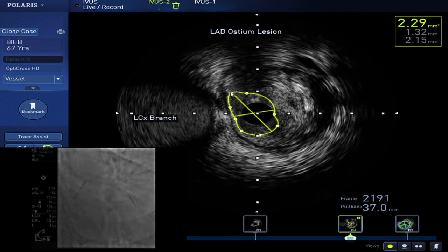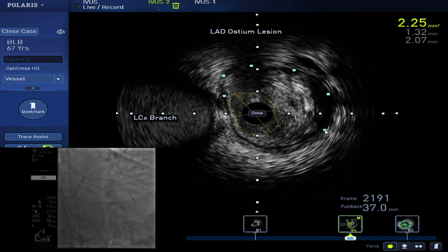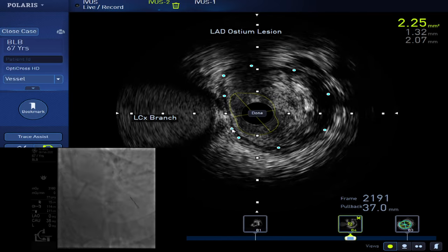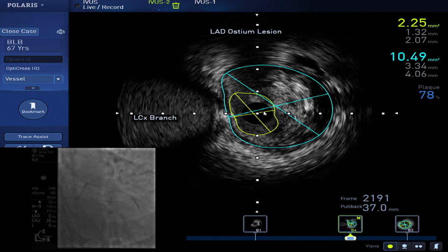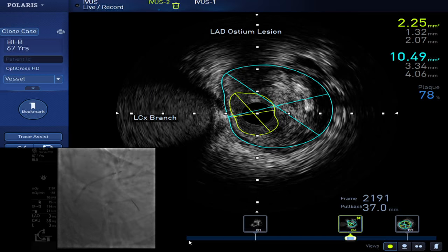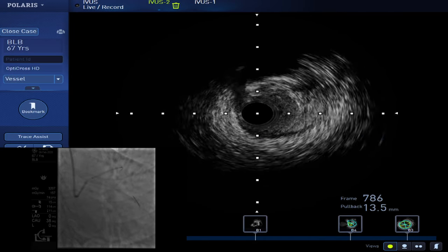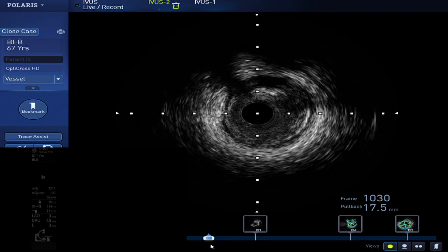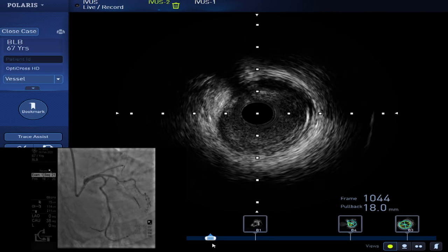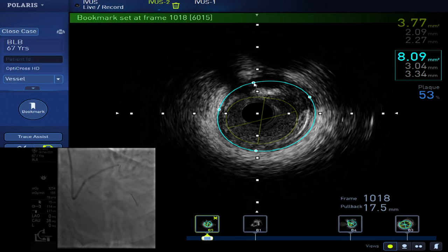So you decide to put one long stent to cover the left main, or two stents? Anyway, after placing the first stent, I will decide whether I need another stent implantation at the distal part or not. This is 3.5, 38. Okay, from here? No. Maybe how about here? Okay, just do maybe a check angio. Yes, okay, go ahead. Go. By 10, first 10.